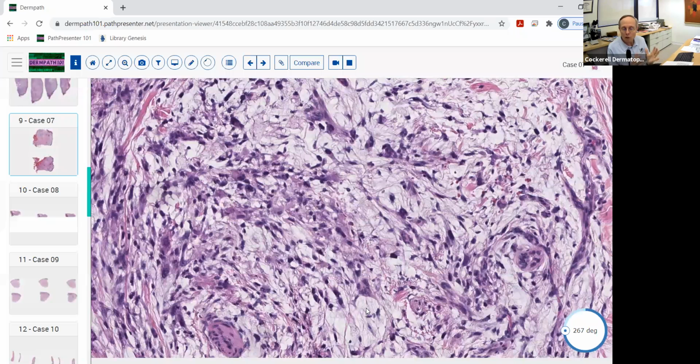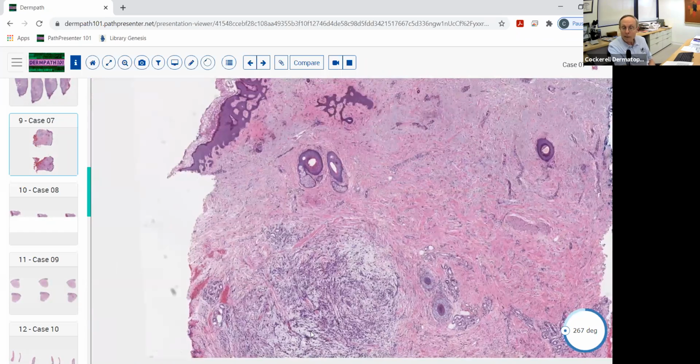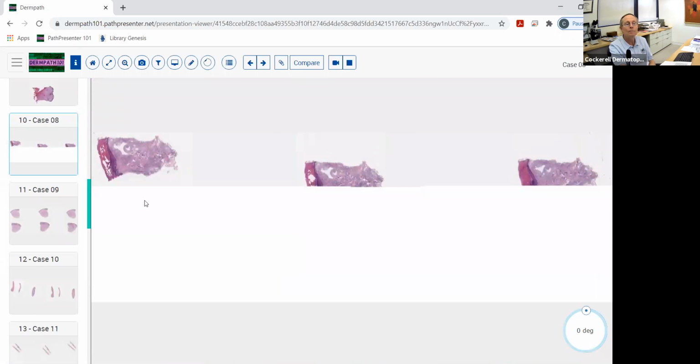a pleomorphic dermal sarcoma. And this was a little metastasis of one of the lesions, or a local recurrence of one of the lesions. The reason we called it that was because it was deep and it recurred. It didn't have an epidermal component, it didn't have a superficial component like the other. It was just a deep atypical fibroxanthoma, basically. So nothing special about that. Just realize that's basically what we're diagnosing these as.